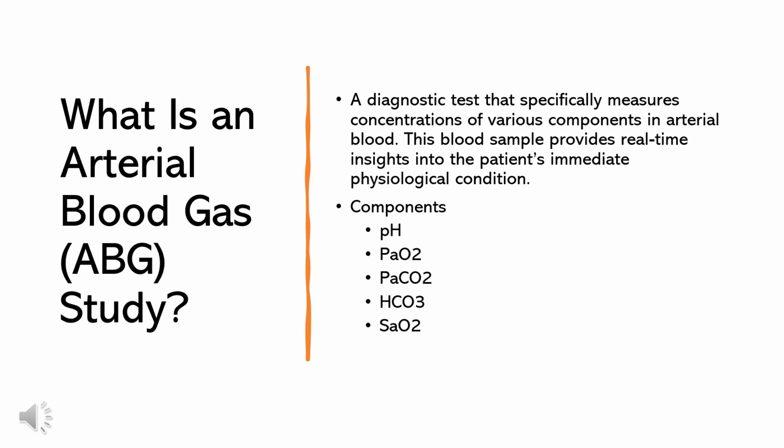The ABG test is not a routine screening test. Rather, it is most often ordered as a response to an emergency or during the treatment of a critical medical condition. Though the radial artery is frequently accessed, there are alternative arterial sites available if necessary, including the femoral and brachial arteries. Sterile technique is non negotiable to mitigate the risk of introducing bacteria into the bloodstream. Strict adherence to sterile procedures is obligatory.